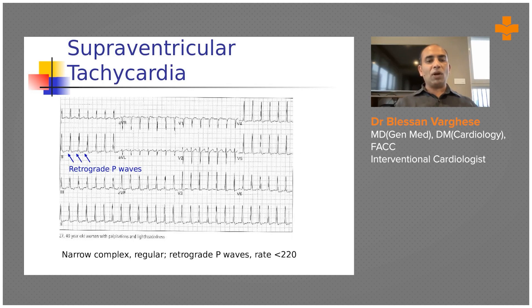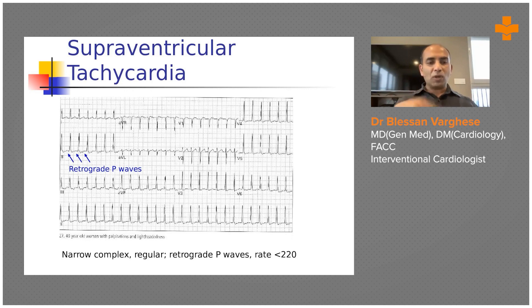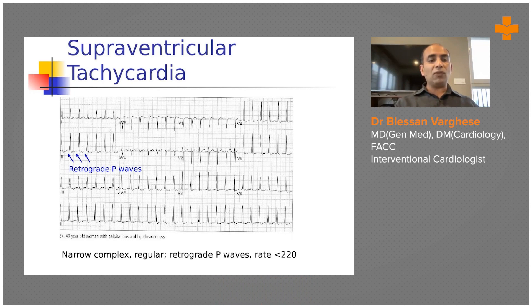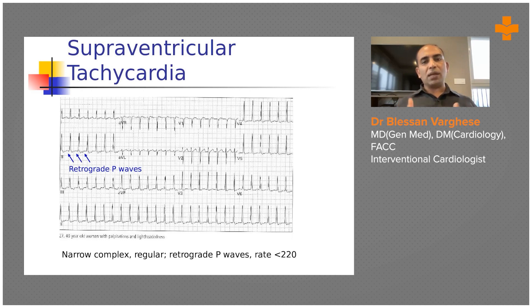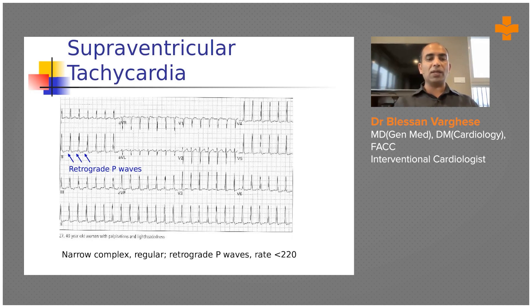This ECG shows supraventricular tachycardia, one of the commonest ECGs seen with tachycardia. The hallmark of SVT is a very regular rate — typically 170 to 190 bpm — that barely varies, due to the AV nodal re-entry mechanism. You will see an inverted P wave at the end of the QRS complex, appearing as a pseudo-S wave in inferior leads and a pseudo-R' in V1. This is AVNRT — AV nodal re-entry tachycardia — treated with IV adenosine bolus, which produces rapid reversion. It is a harmless arrhythmia.